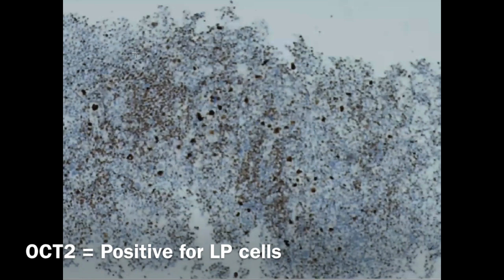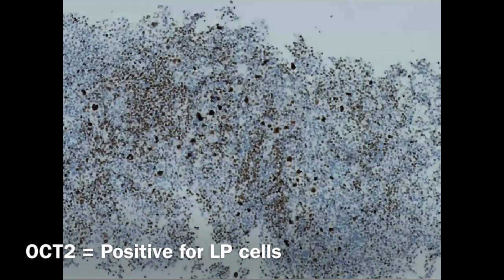Accordingly, these cells are preserving the B cell antigen markers. This is the OCT2. As you can see even from low power, these cells are big and taking the stain. In the classic type, these cells don't preserve the OCT2 stain.